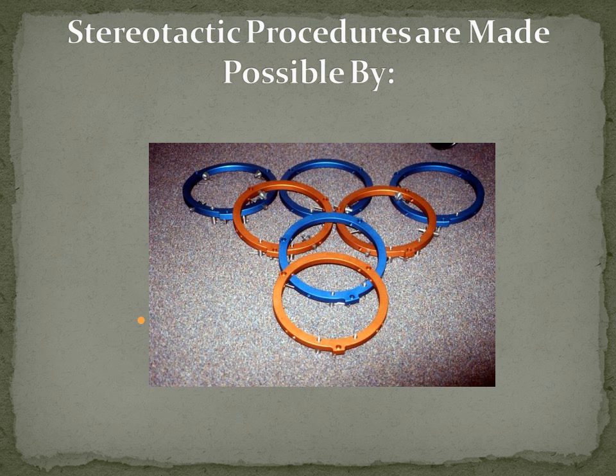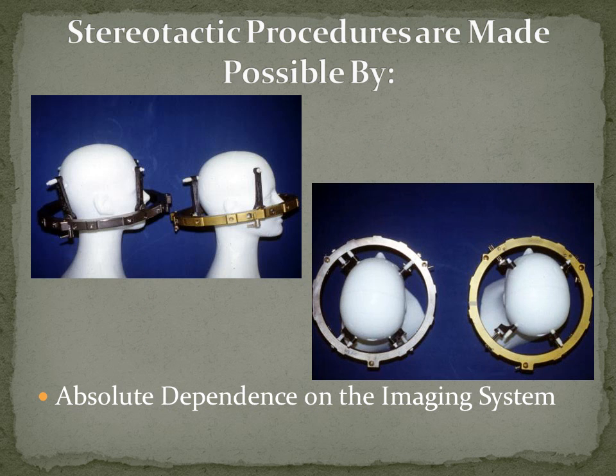So what makes this all possible? The head rings. This is our set of head rings that we use at the University of Florida. You'll be seeing these tomorrow morning when we do the head ring application lab.